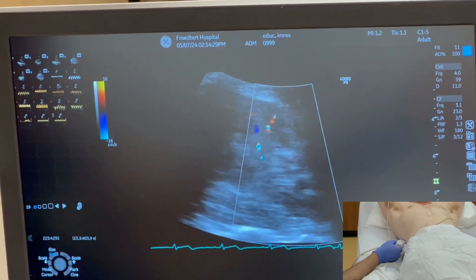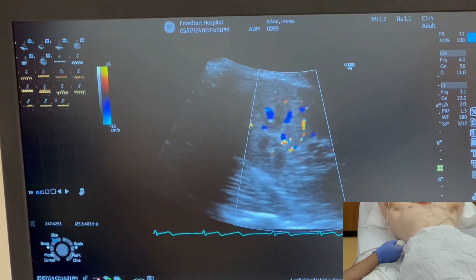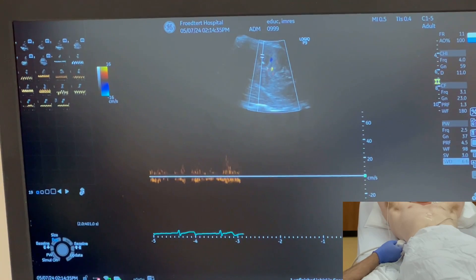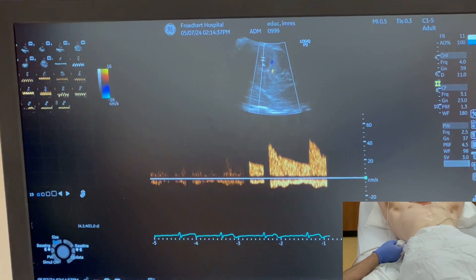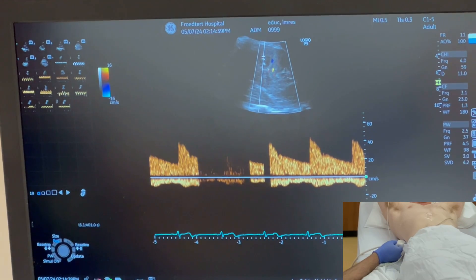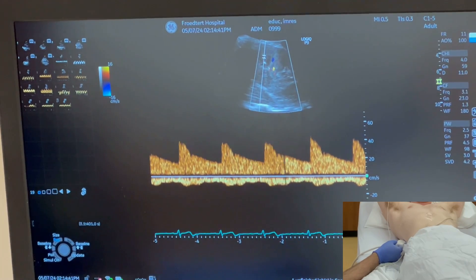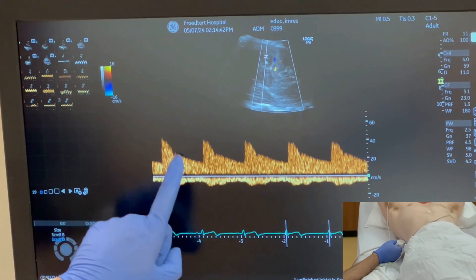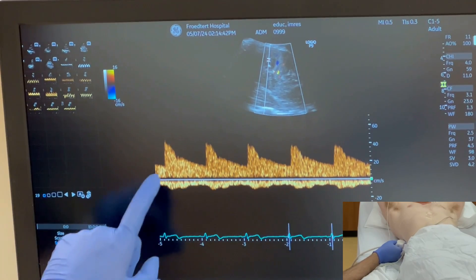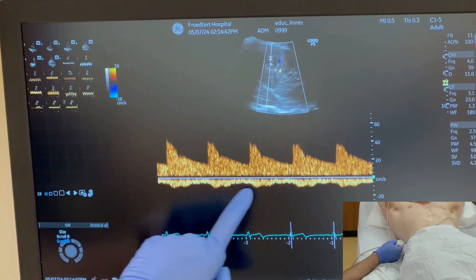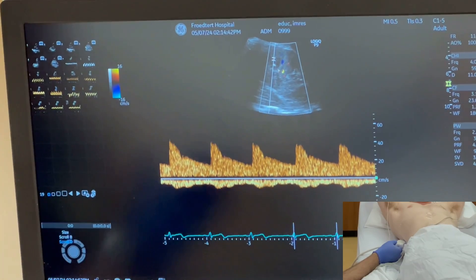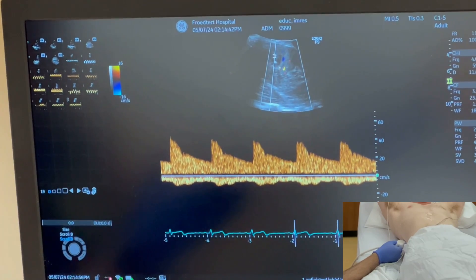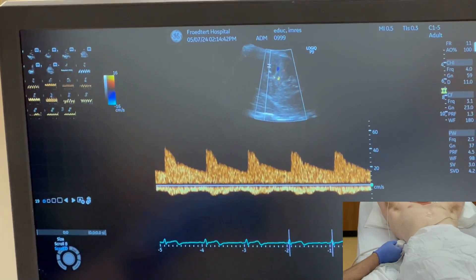Breath holding is really necessary here. I'm going to sample these interlobar vessels and you are getting a nice tracing above and below the baseline. Above the baseline is the arterial waveform — a systolic spike followed by diastole, repeating. Below the baseline is a continuous venous waveform without any breaks or discontinuities in the cardiac cycle. That's completely normal.